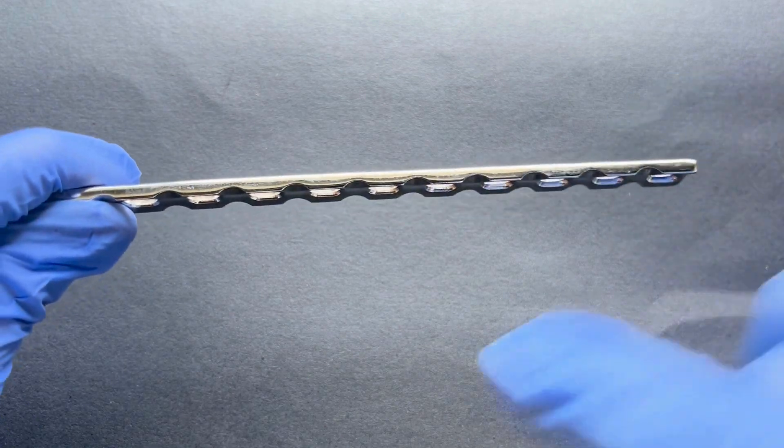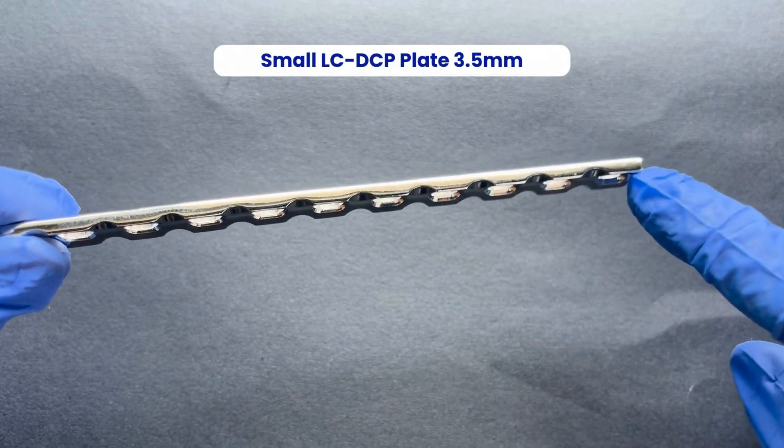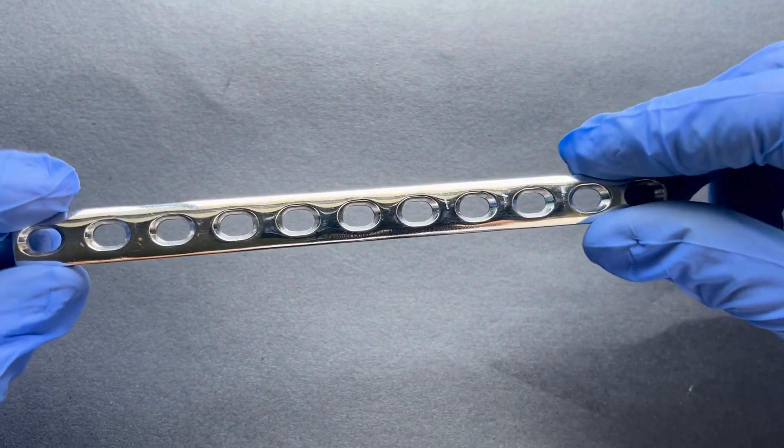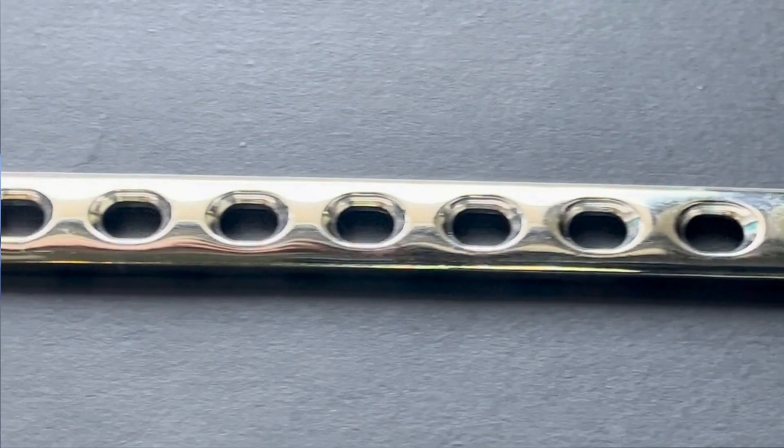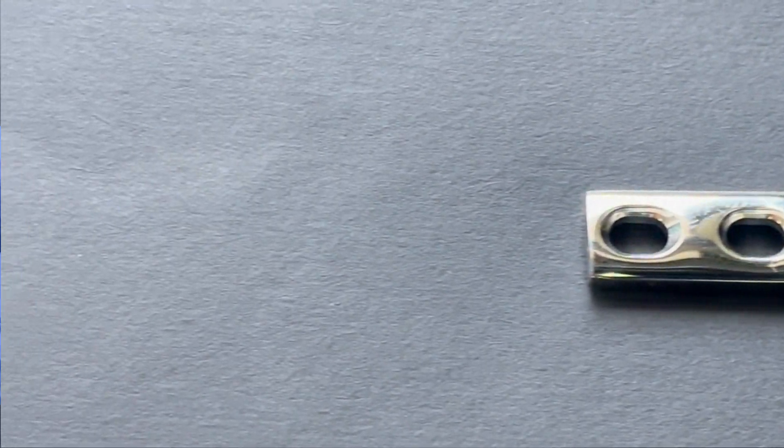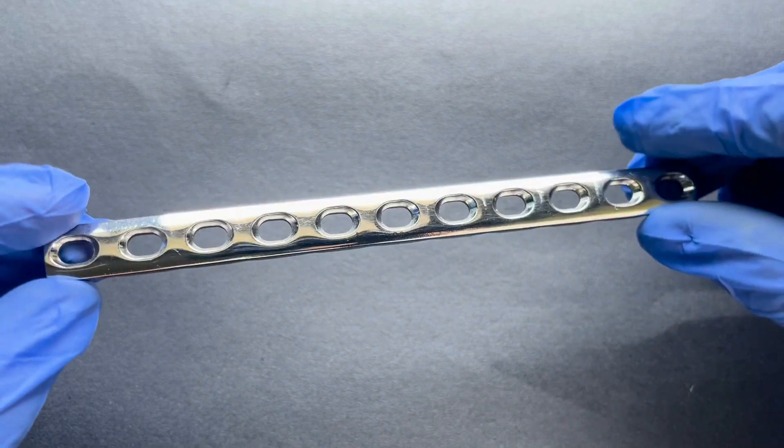Next in line is the 3.5mm small LCDCP plate. It combines limited contact design with dynamic compression for smaller bones. It reduces periosteal disruption while achieving strong interfragmentary compression.